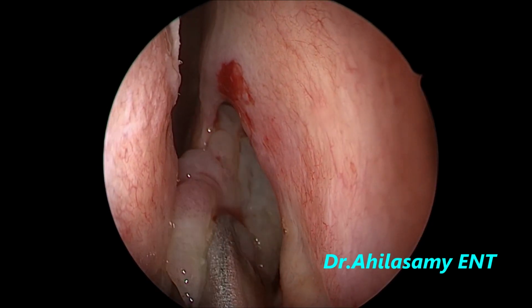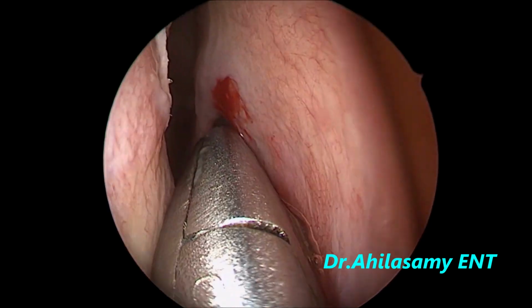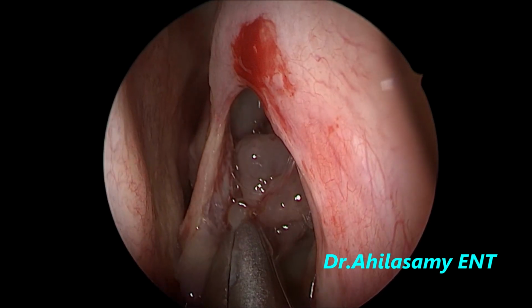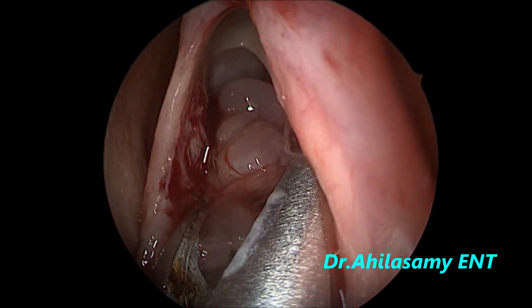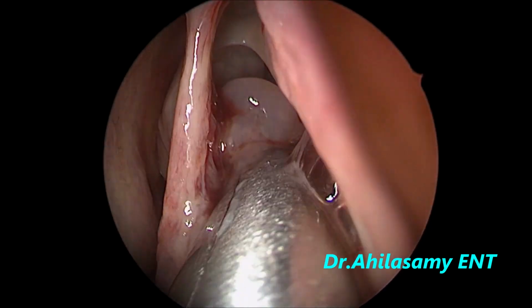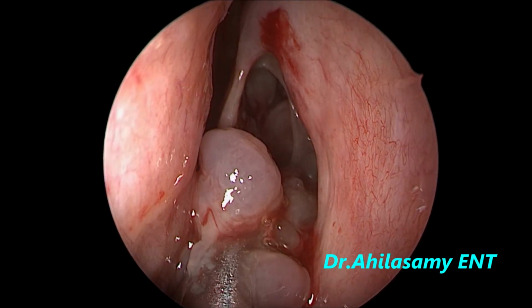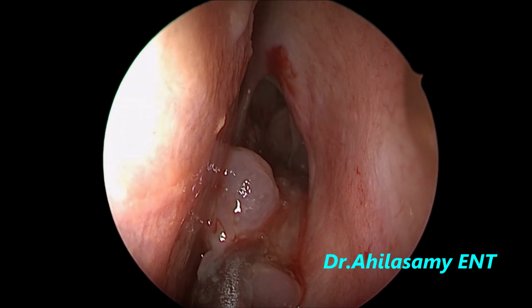So for biopsy, I am taking the maximum part of the specimen, thinking that it could be an inverted papilloma, for histopathology. So gently taking it out. The mass is filling the middle meatus and anterior to the middle turbinate, and it is occluding the middle meatus.